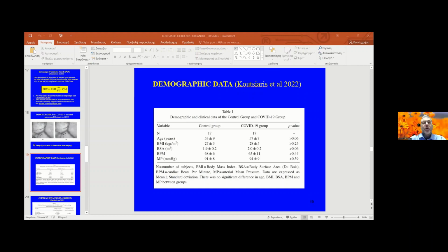And as I'm going to show you right now, there are 3 windows in the human body for non-invasive measurements in the microcirculation. First, the sublingual tissue window at the bedside with tissue contact. Second, the fingernail fold window at the bedside with tissue contact. And third, the conjunctival tissue window with no tissue contact. So there are 3 windows, and of course, in all of them, we need some kind of magnification because, as you all know, microvessels are not visible to the human eye. So we proceed with the first window.